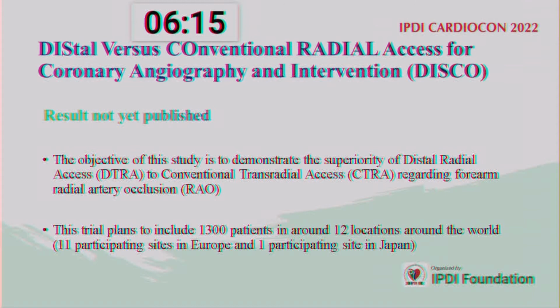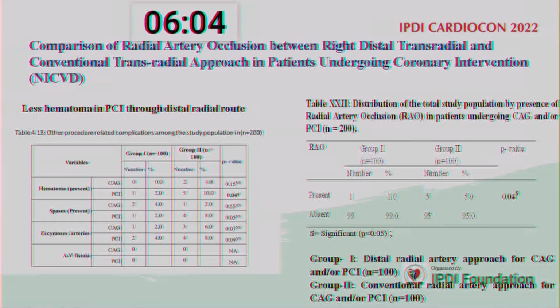And this is distal versus conventional radial, the DISCO-RADIAL trial. This is an ongoing trial, over 1,300 patients and 12 locations in different countries, and it is going on. The target is to show that radial artery occlusion is less in the distal radial approach.